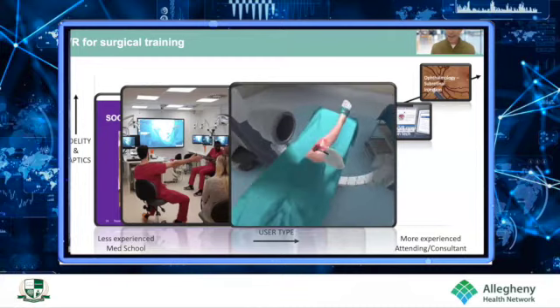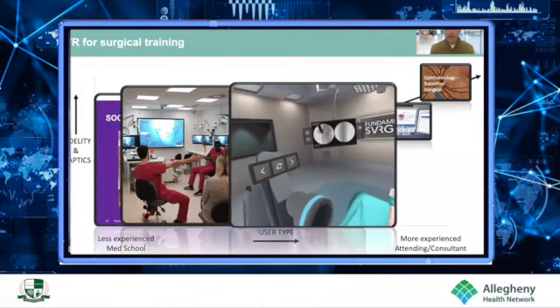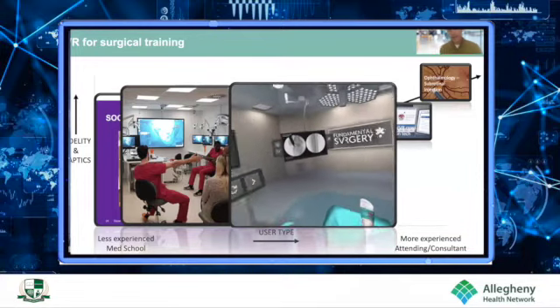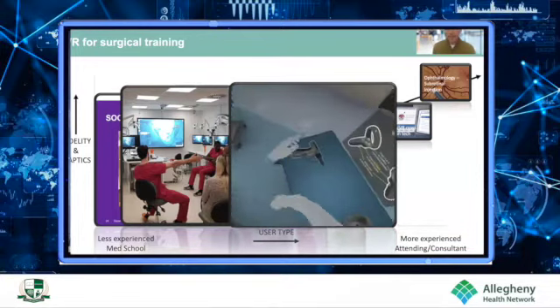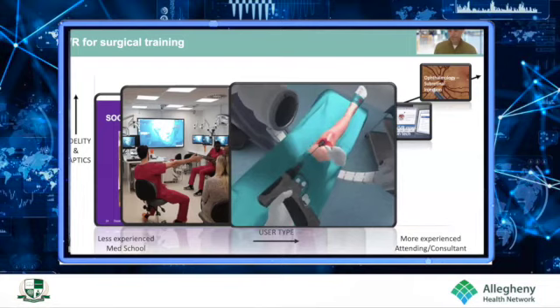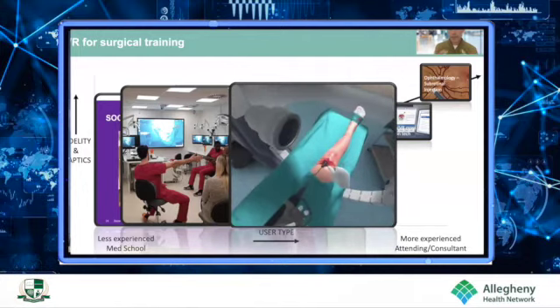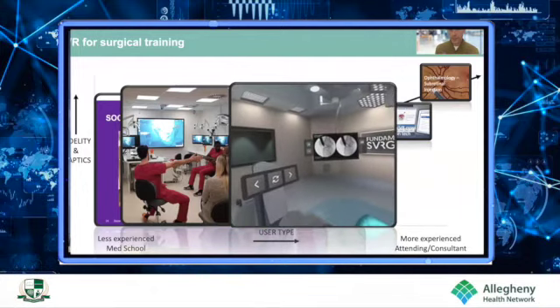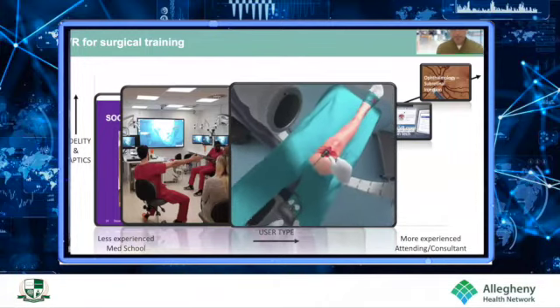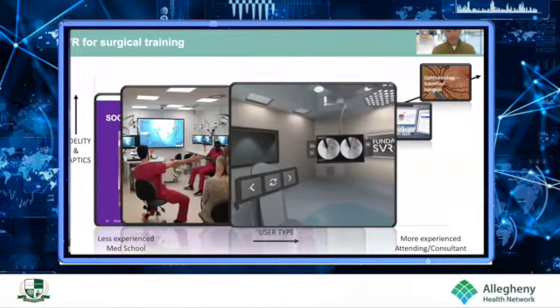Examples of that, again, in action here, you can see with this one, this is from a tibial nail, and you can see some of the live imaging capabilities that these systems will deliver as someone's learning the skill here of getting their approach correct before they start that nailing process. And this will give real-time feedback. You'll see the advancement in a second of that drill into the leg. As you can see there.